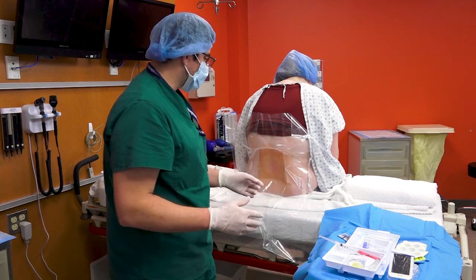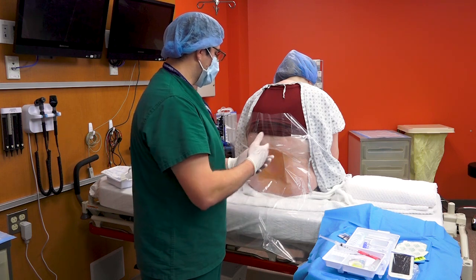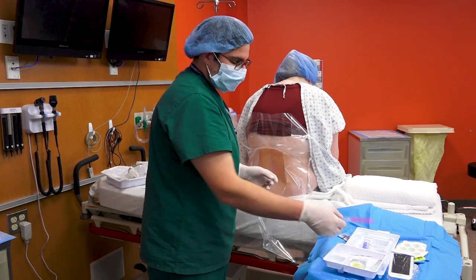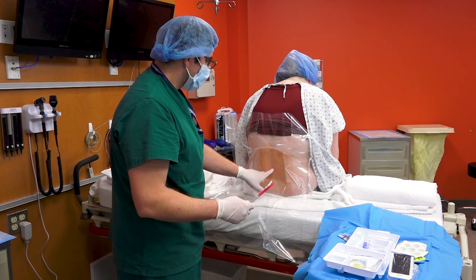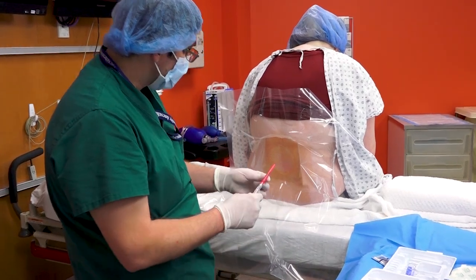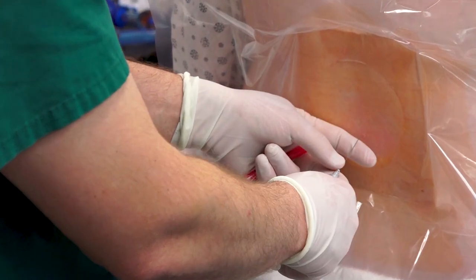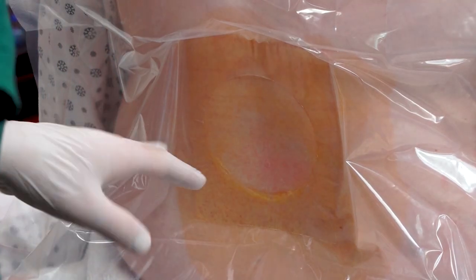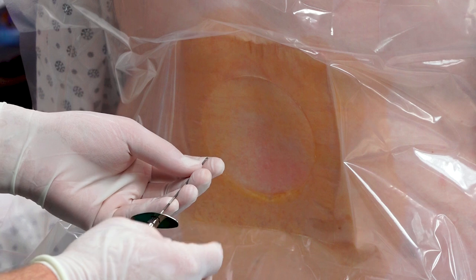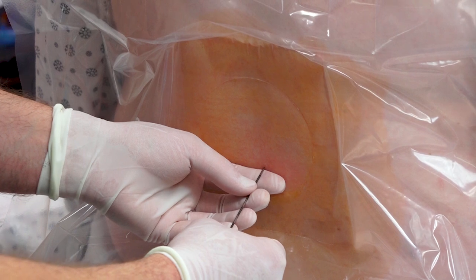It's very important to remember that ultrasound is a snapshot of the image at the time the image was taken. For that reason, it's extremely important to have everything as ready as possible so that as soon as you finish performing your ultrasound markings, you can go ahead and perform the procedure. First, make sure that we still have our markings, then start by putting local anesthetic in that area. Remembering the angle at which the ultrasound image was obtained, we will start advancing our Tuohy needle.